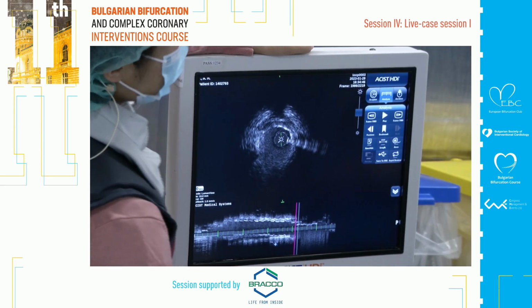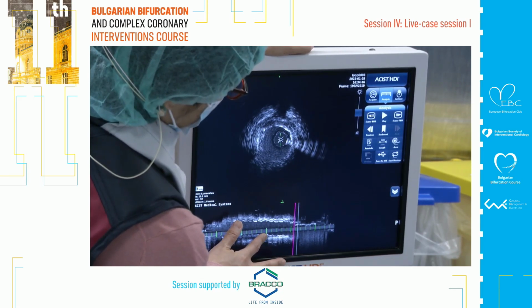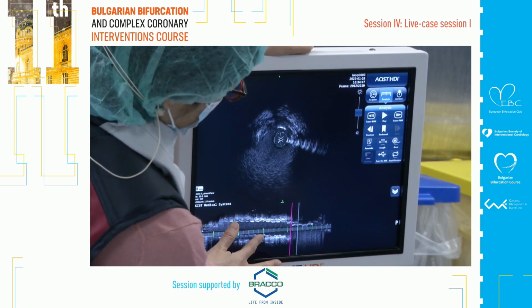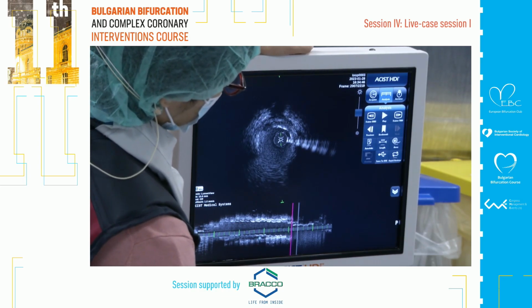It's a minimal protrusion. It's protruding, in fact. Very minimal. We do not cover the ostium, I believe, downward, not the roof, but okay. The diffusion of the drug will do well. Good work.